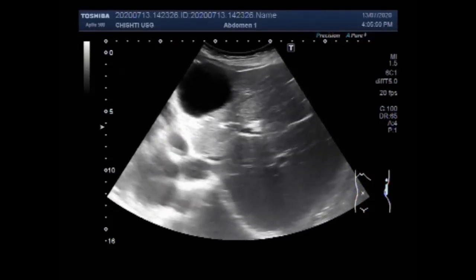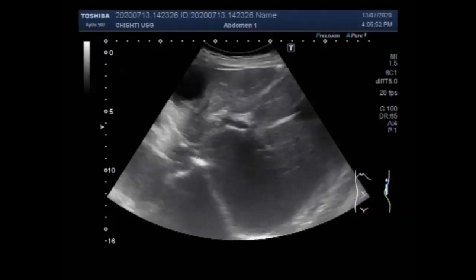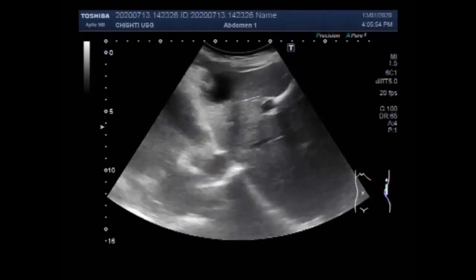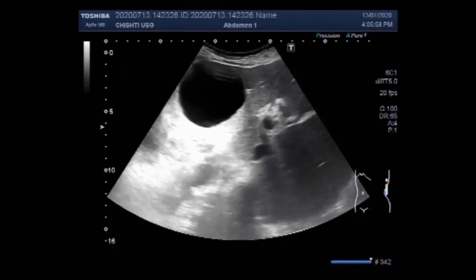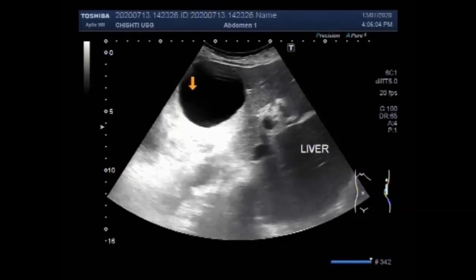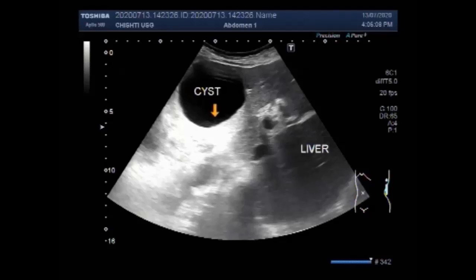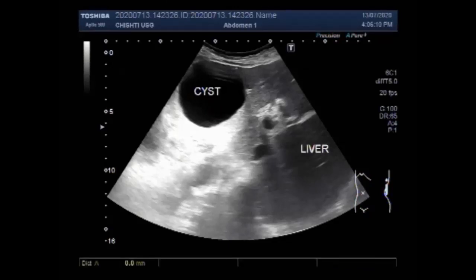You can see the liver, and a large hepatic cyst is seen in the upper portion of the left lobe of the liver. This mass is round to ovoid in shape. It has slightly turbid fluid in its interior and measures about 6.2 cm x 6.2 cm.